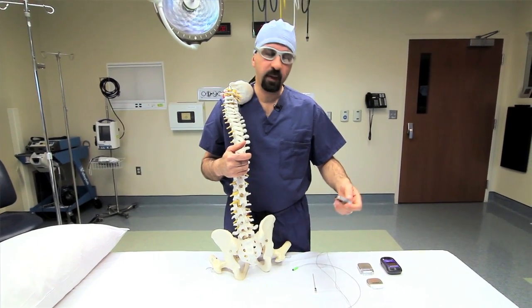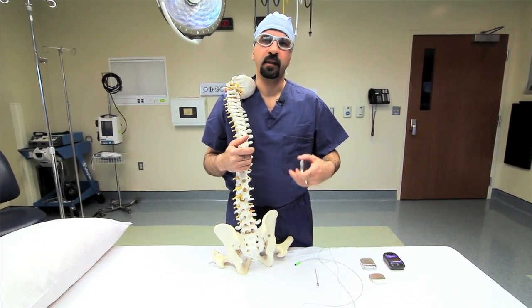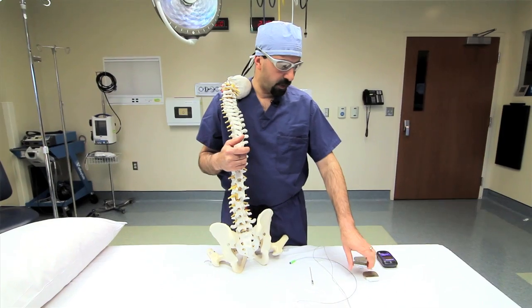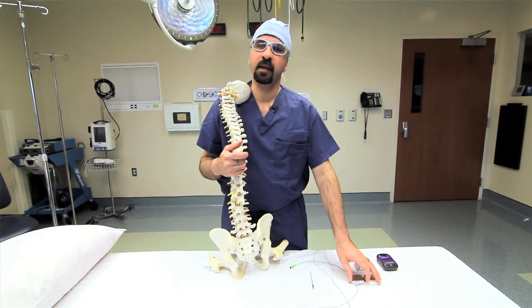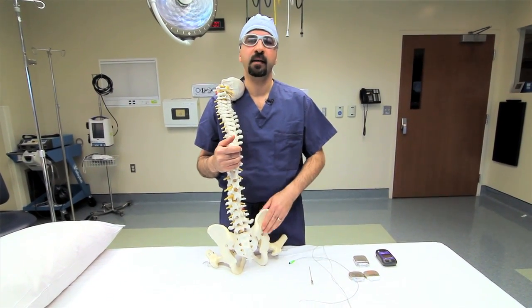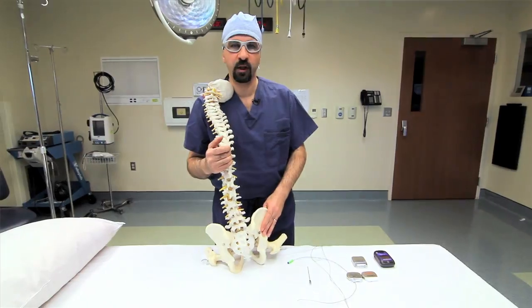The recharging of the battery depends on the volume, the amount and the time of usage by the patient, and how much amplitude you are using for the spinal cord stimulator. That dictates how frequently they have to recharge the battery.